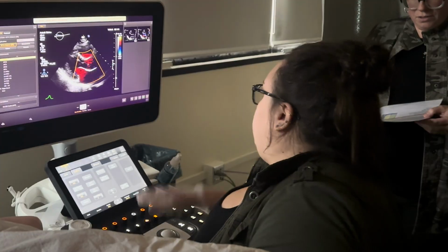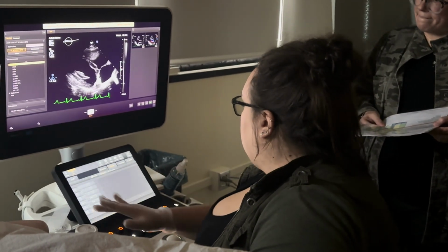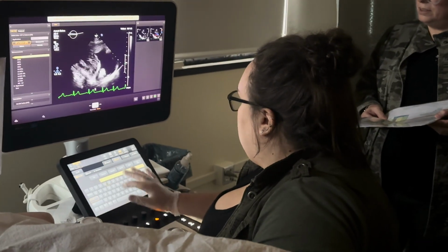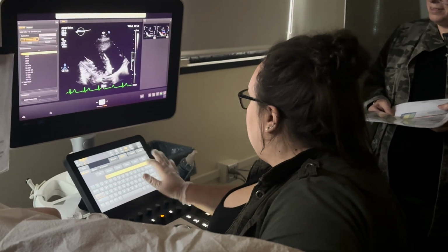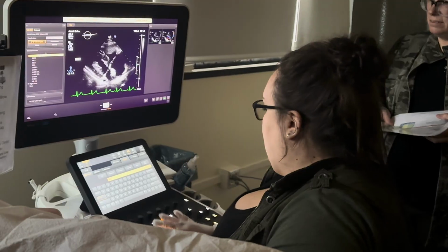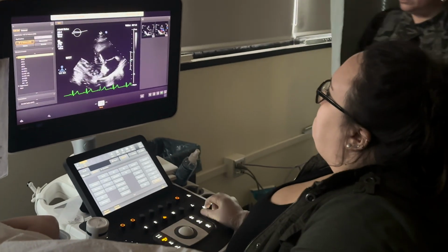All right, now you're going to go to RVIT. You have to type it. I know, we have to fix presets. Add it to the list. Set home. There we go.